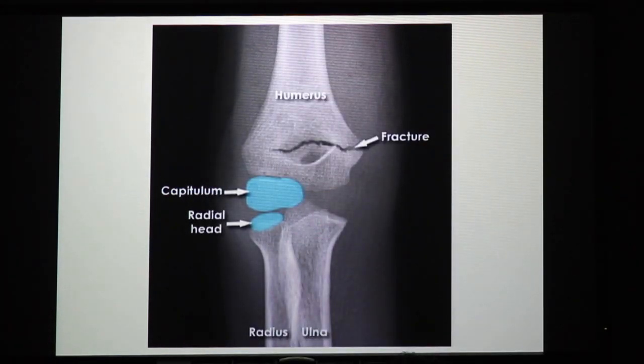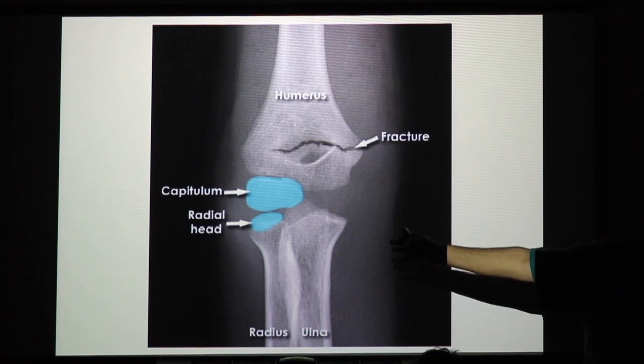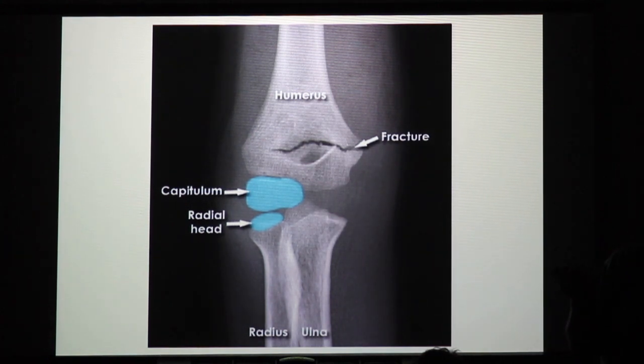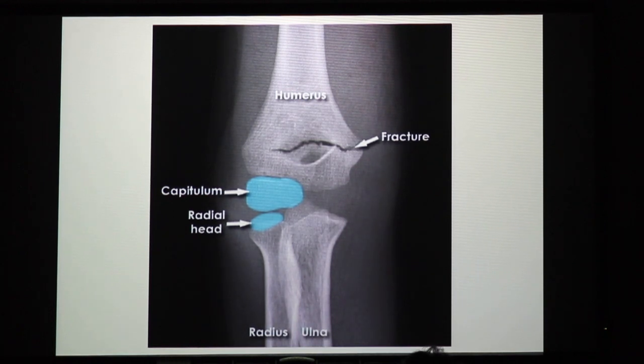Yes, gentlemen. Why don't we see it? Because it's not even visible nicely, so you can comment on that. It's in the process of reformation. Right? Obviously these types of X-rays we will never put in your exam, because we understand you are just our new babies. Thank you. And we don't want to kill our new babies, but just to give you a little bit of sweat, these things have been implanted.